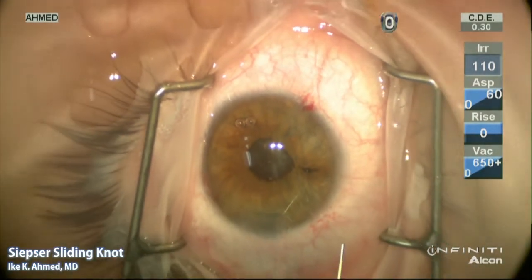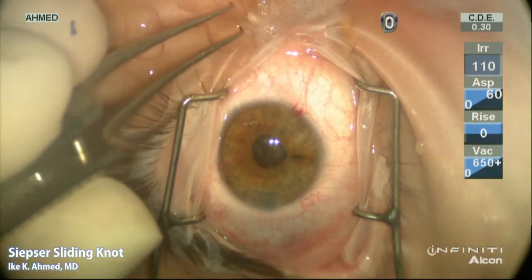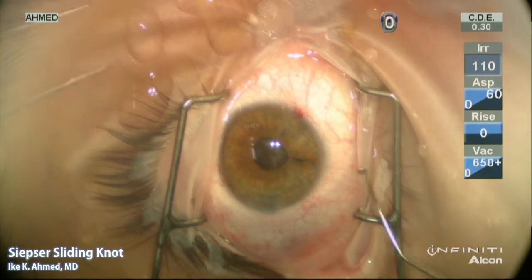It's important to have two paracentesis through which the needles have been passed. At this point, one will note a proximal strand at the bottom of the screen, as the surgeon's view shows, and a distal strand visible on the superior aspect of the screen, or the nasal side from the surgeon's perspective. It's important to differentiate the proximal from the distal strand, as we'll show in the next few steps.